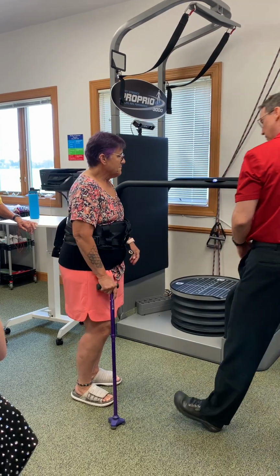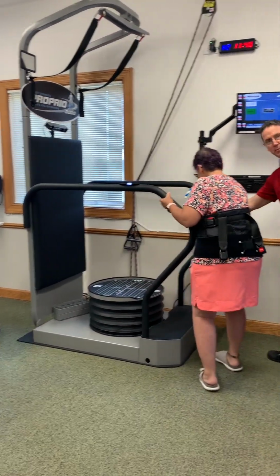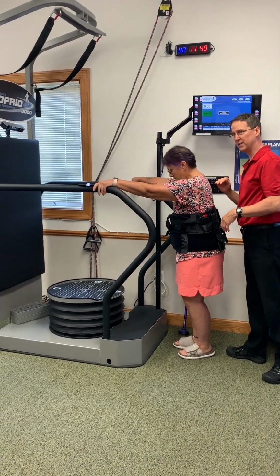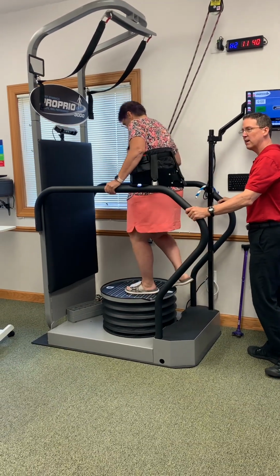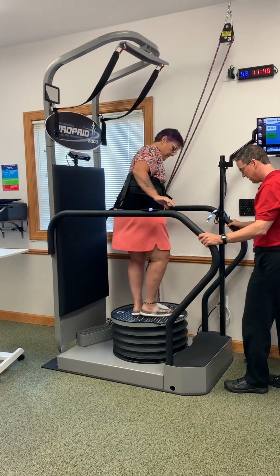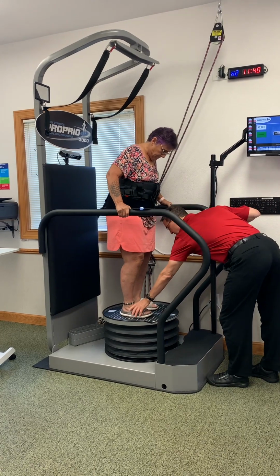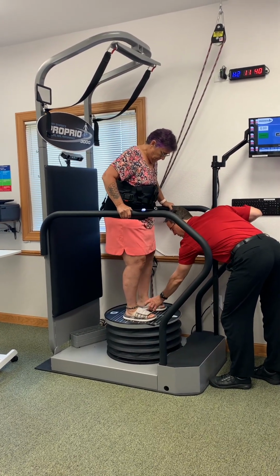All right, perfect. So she's got her safety harness on. She's going to come up here. This can even tilt down a little bit to make for a shorter step. Trust me, everybody can get on this for the most part, as long as you can stand in some capacity. Very solid handrails. You're going to turn around and face me, if you would, please. And then I'm going to have you position your feet maybe just a little bit forward here. Oh, you got it up.